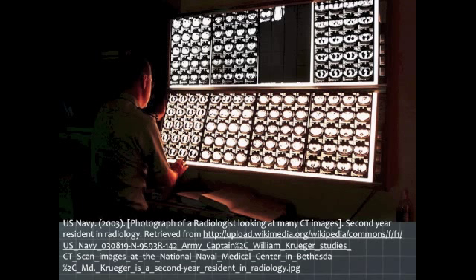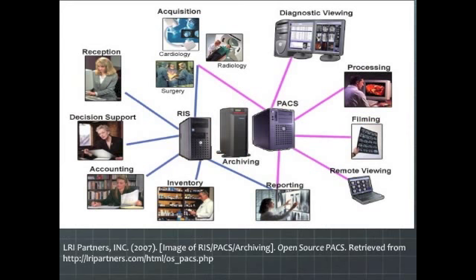But a radiologist can read literally anywhere in the world using PACS if they have the access, the privileges to get in there and look at it. Some of our referring doctors who refer to us a lot, we give them privileges so they can look at their images in their office on our PACS system. We use GE, but there's other vendors, Philips and other big names in medical imaging that have come up with their own software that you utilize. You log into that software and you can see anybody's images, whatever they've had done. And it's a lot easier.